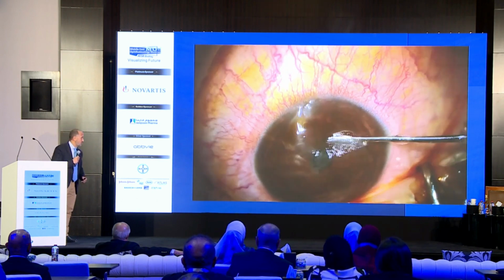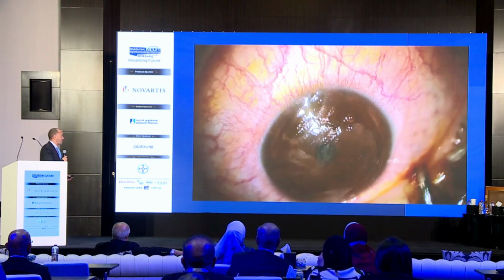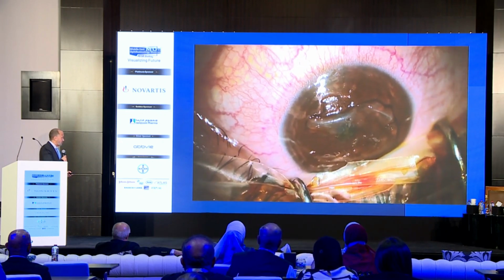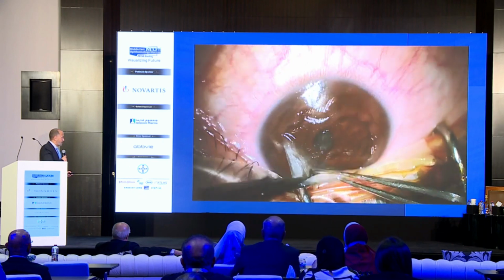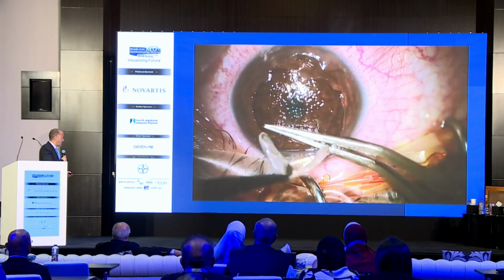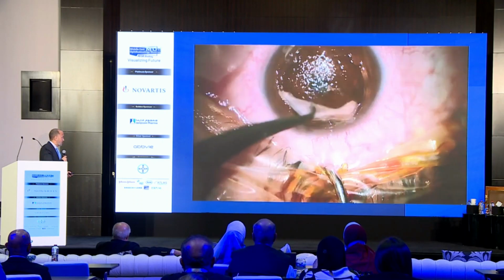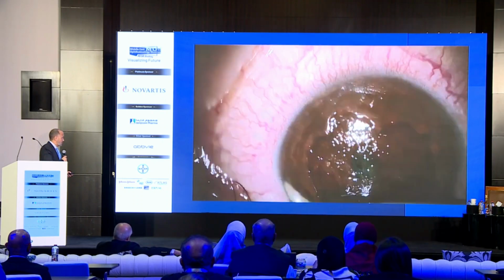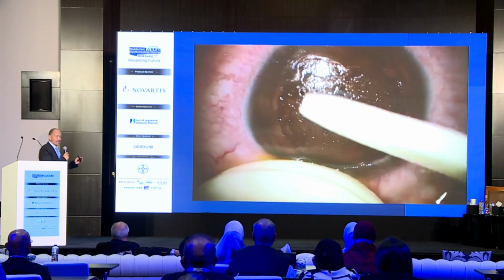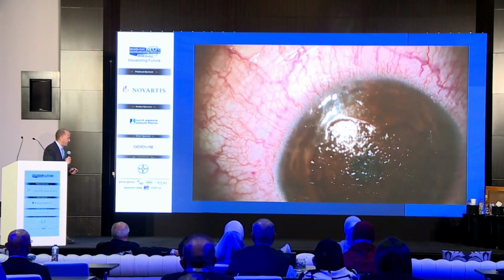Yeah. So this is basically what happened. The flap was molten. It melted in the lower part, and there was a lot of epithelial ingrowth. I decided to amputate this flap. Nothing fancy there, just to show the procedure. Again, a lot of these irregularities that you can see are nests of epithelium causing pits and melting in the stroma of the bed.